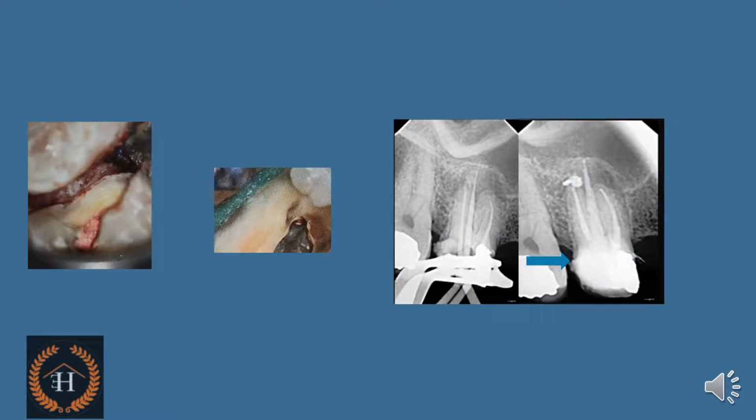Once that is achieved, you can fill the rest of the endodontic cavity either with composite and light cure it, or you can even pack amalgam. Once the amalgam is set for the initial 15 minutes, you can remove this band of resin matrix either with an explorer or with a finishing bur.